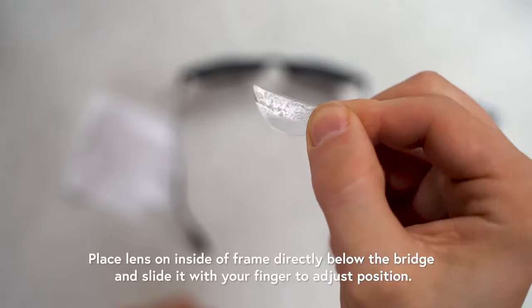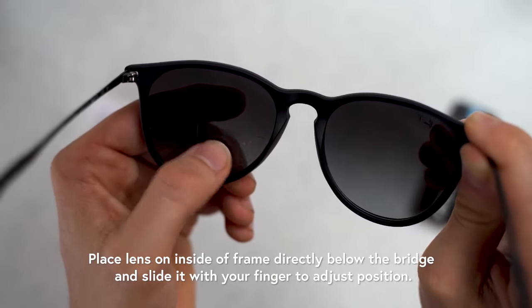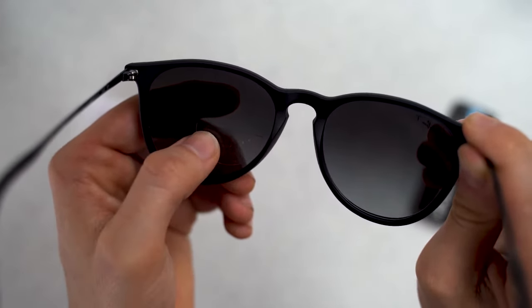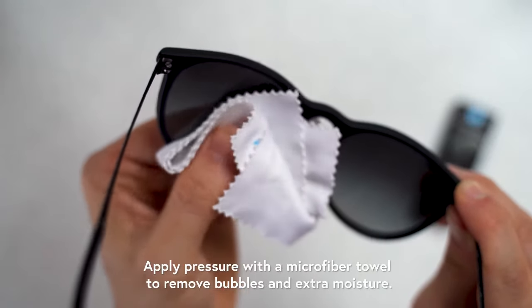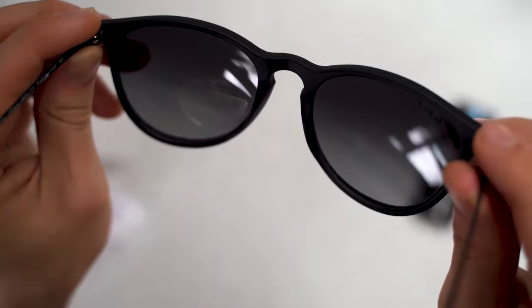You can apply either side of the lens to your glasses. Place a lens on the inside of the frame directly below the nose bridge and slide it with your finger to adjust its position. Apply pressure with a microfiber cloth or soft towel to remove bubbles and excess moisture.